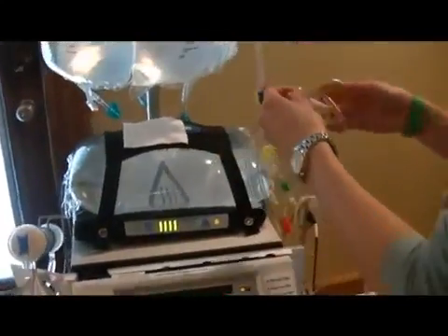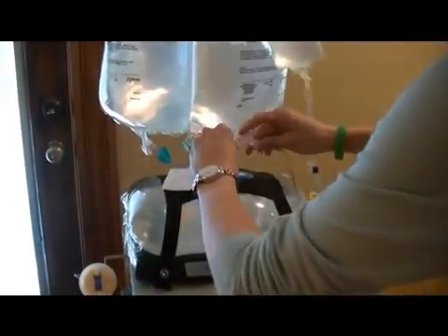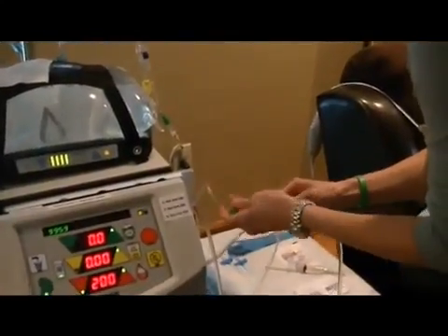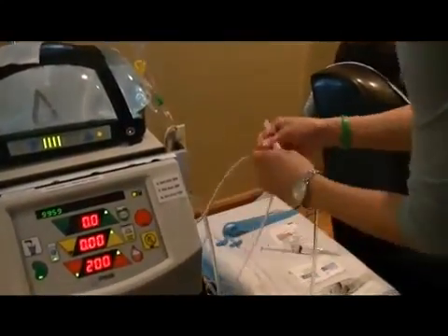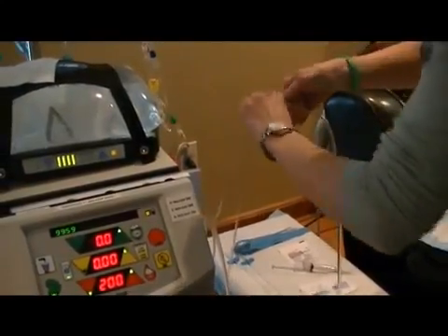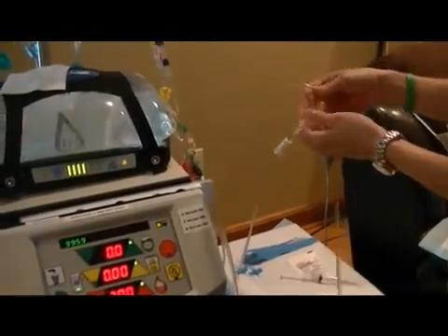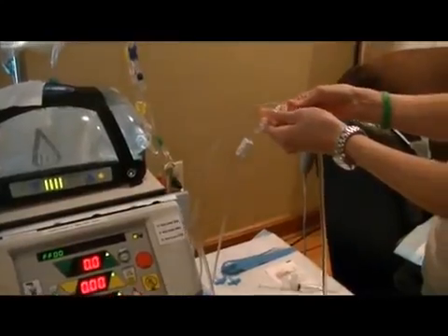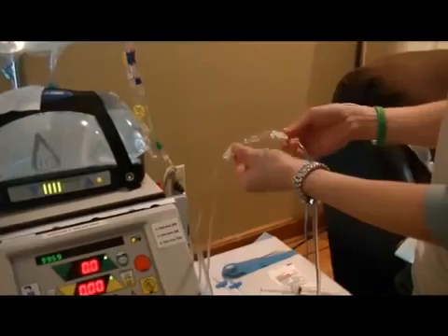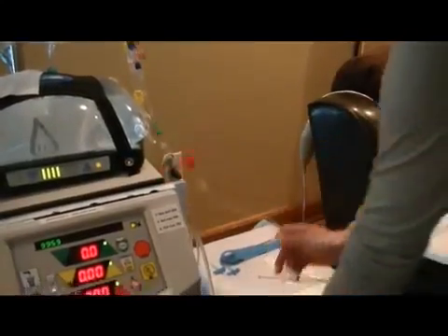This is the saline line here, and you drain it and clamp, and then you unhook these two. So this is the saline line, what I'm clamping together here, and you leave those clamps closed. The only reason you would open them is if you needed to do a manual rinse back, or if we needed to actually add fluid to him if he was dehydrated or under his dry weight, or if he starts cramping during the treatment, you can open these up and give him some saline.